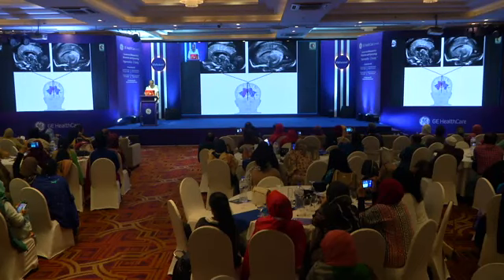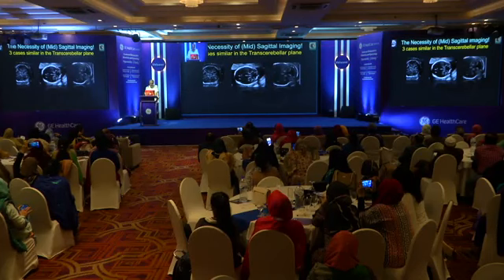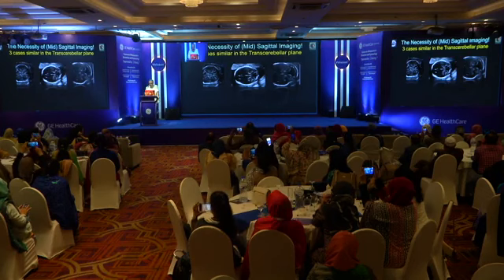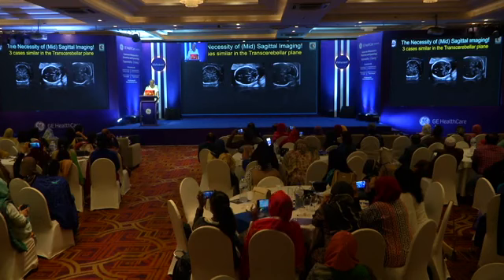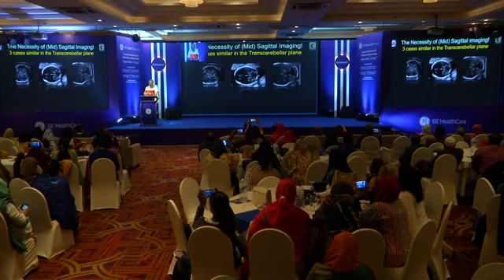Remember that if you don't do this mid-sagittal plane, you will not be able to differentiate between a normal Blake's pouch, between a Blake's pouch cyst and a Dandy-Walker malformation. And there's a huge difference in the prognosis. So this mid-sagittal plane, in fact, is truly something to be looked at even in your normal routine anomaly scan.